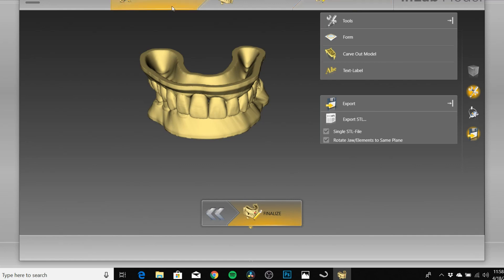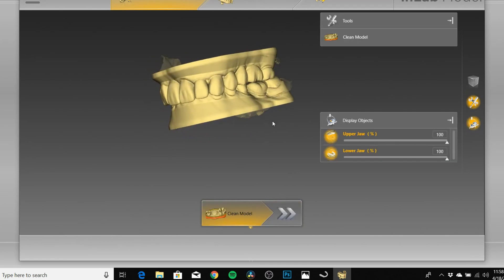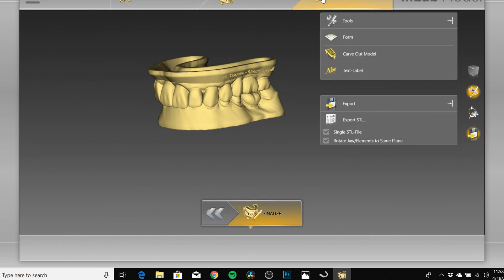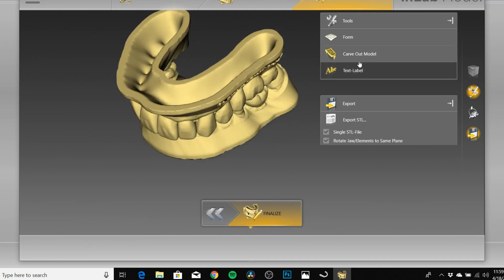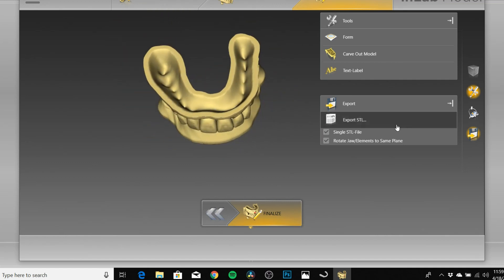Once we're here, in Prepare you're pretty much just going to trim the model where you want it — I've already done that. We're gonna skip the Design phase since that's more for crown-and-bridge model work, and go straight to Finalize. Once you're in Finalize, I usually hollow out the model to save on printing time and material. With the text label you can indicate the doctor's name, patient name, and so on. At that point it's ready — you export it as an STL, nest it in whatever slicer software you're using, and send it over to your 3D printer.